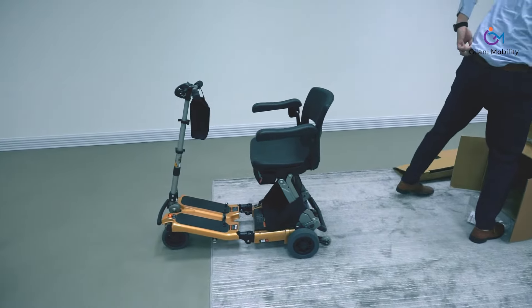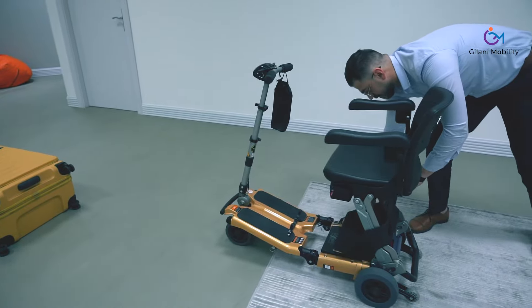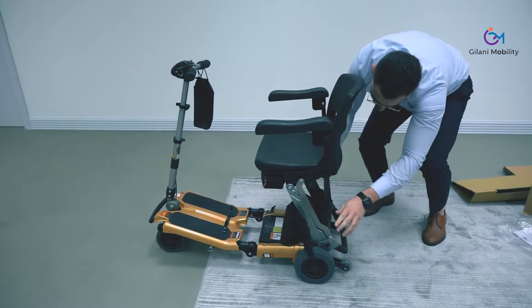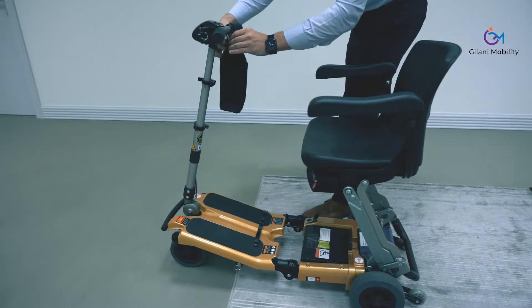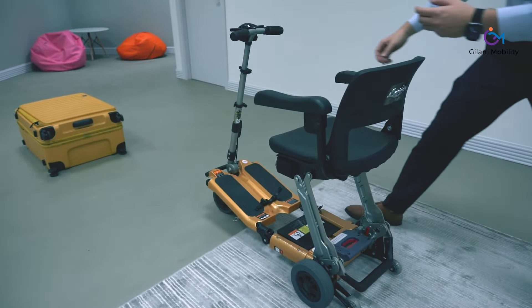The Luggy series comes in seven different options for different users and purposes. You can see the small anti-tipping wheels at the back of the scooter, which allow you to go up even the steeper roads without feeling uncomfortable or concerned about tipping backwards.